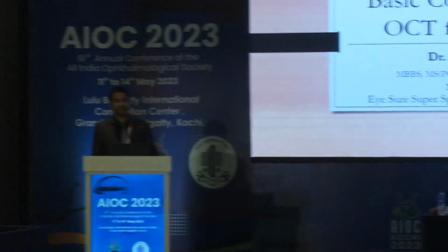A very good morning to all. At the outset, I would like to thank AIOC and Dr. Sushmita and Dr. Pandav for giving me this opportunity to speak in front of you. So as ma'am has pointed out, red is not always abnormal and green is not always normal. So going back to the basics, I'll be telling what is normal, what is abnormal, what is red, what is green, so that we can interpret it in a better way.